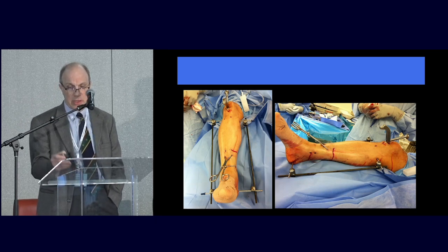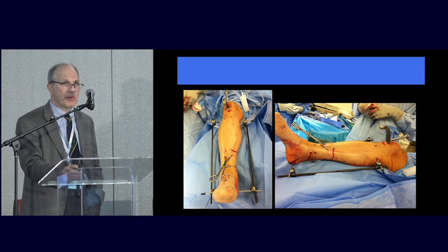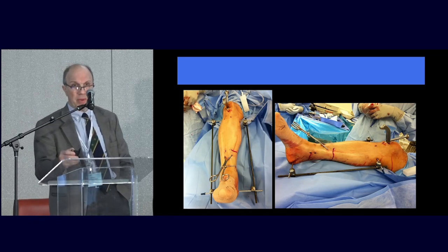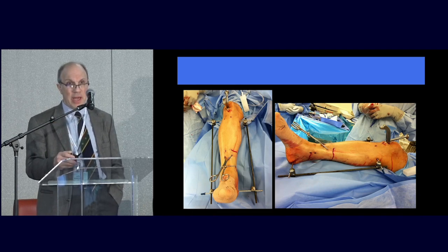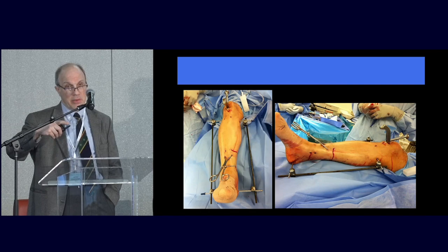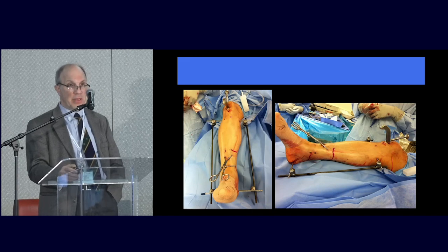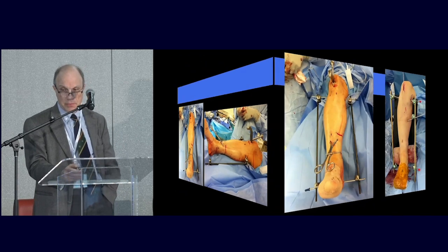And you can see also you can apply the percutaneous clamps in a segmental fracture. One of the problems with segmental fractures, the worst thing that can happen, I don't have a perfect example here, is the middle segment, when you are reaming in the isthmic area, the reamer can get caught and spin the middle fragment with the friction. I usually put a percutaneous clamp, something like this, on the middle segment when I'm reaming in a segmental fracture.